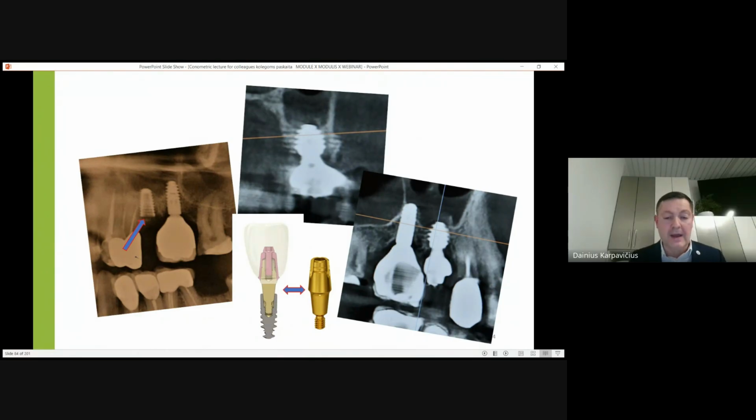Technically, in certified laboratories, fatigue tests of implants and accessories are about 5 million cycles of chewing imitation, which is about 10 years. But what about 15? What about 20 years?